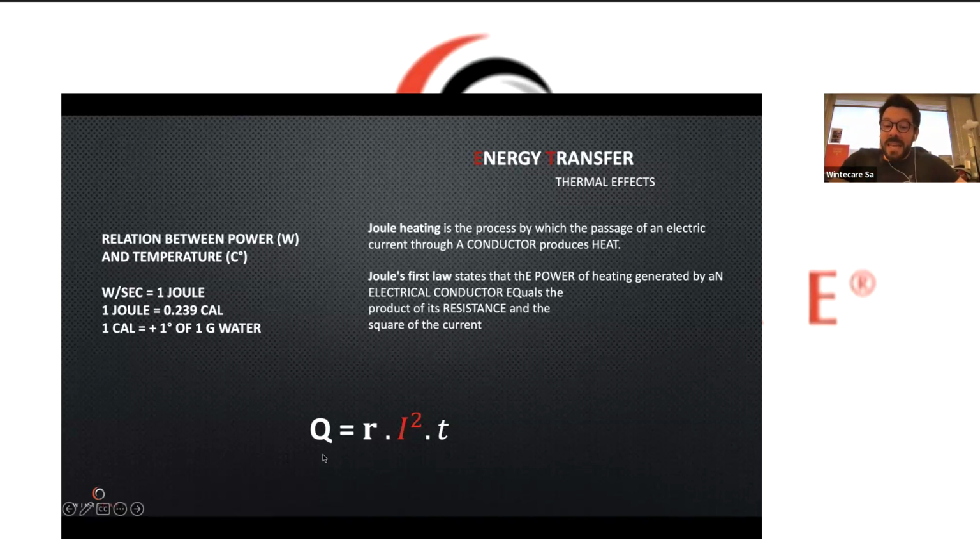So when we need to reduce the time because we want to earn more money, or we are pushed to get results because we are working in sport or anything related to time, we need to increase our current flow in order to save it. And this will have an impact in terms of energy transfer.